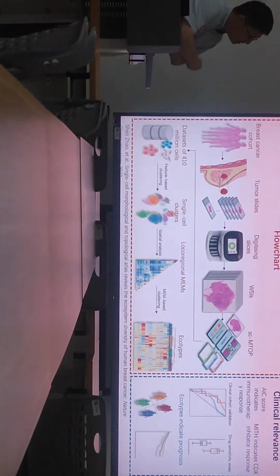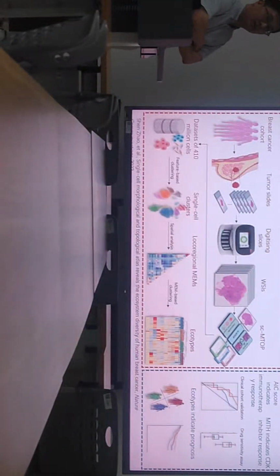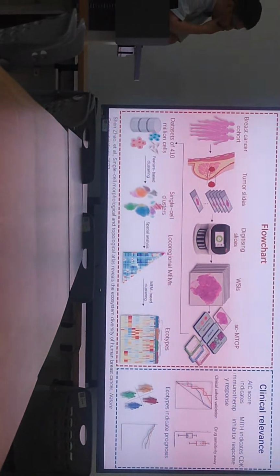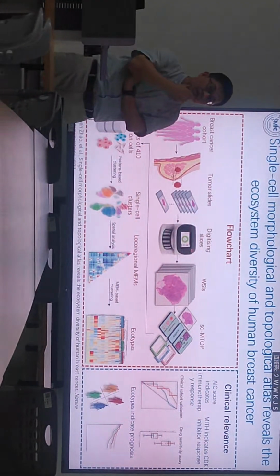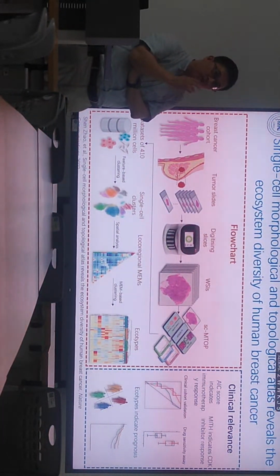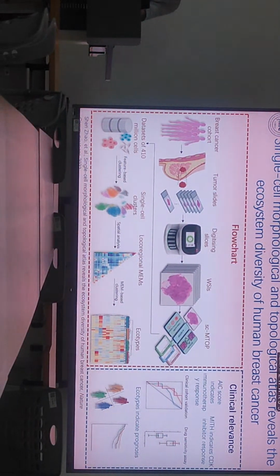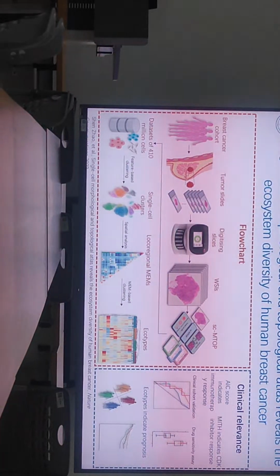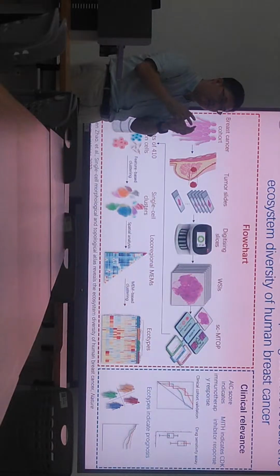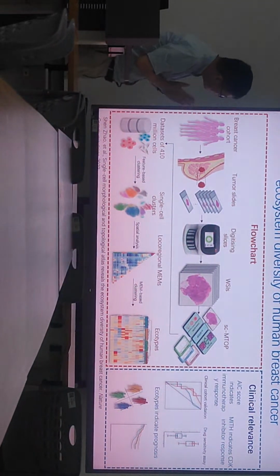And also, I think machine learning is very powerful for analyzing thousands of cells. For instance, it's very hard for us to count tens of thousands of cells. However, we can train the model to analyze tens of thousands of cells. Why is this important? Because the statistical information can reflect the prognosis of breast cancer. This is an example.